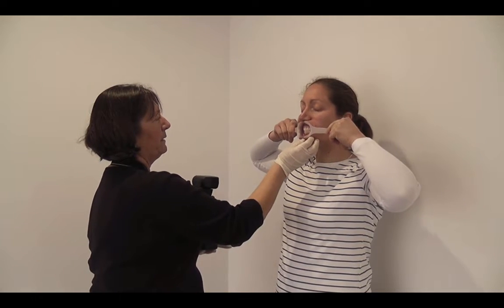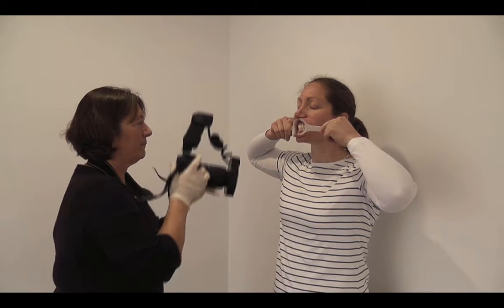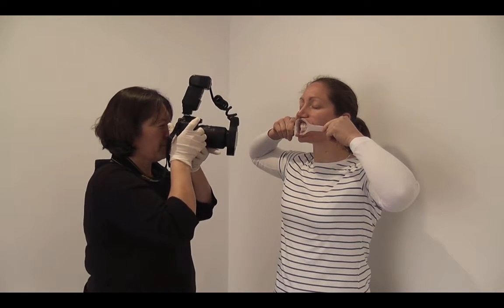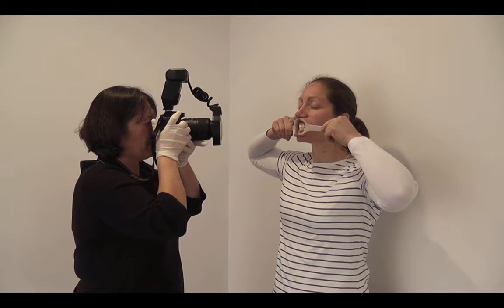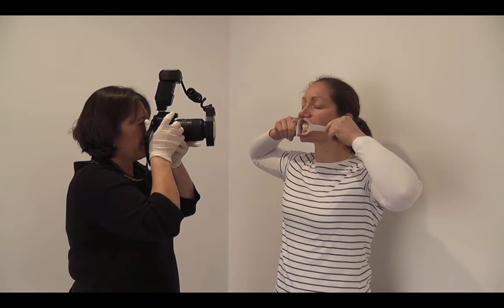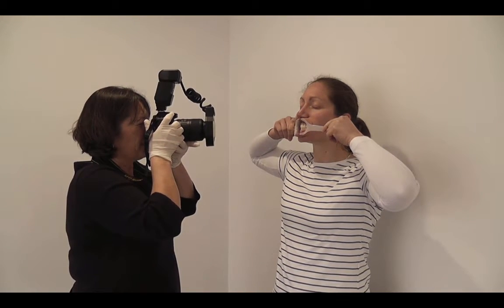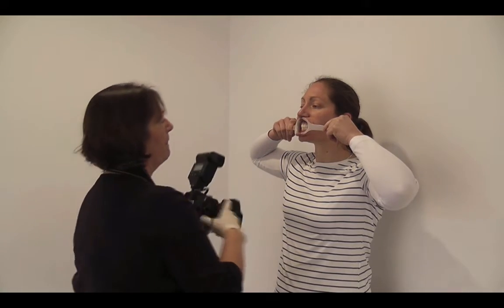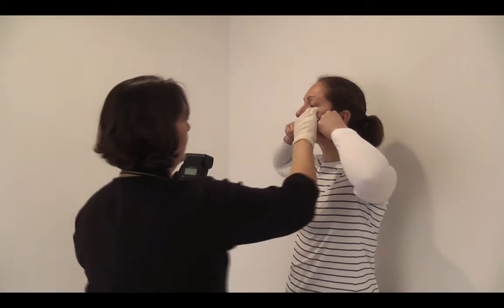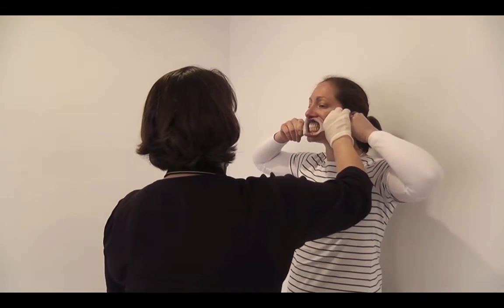Now take a photo of the right side of the mouth, still in occlusion, focusing on the labial aspects of the canine and having the buccal aspects of the molar in clear view, as far back in the mouth as possible. Now perform the same on the left side of the mouth.